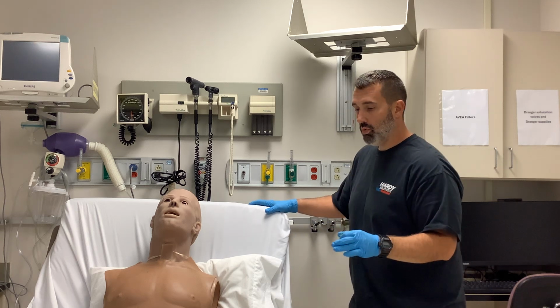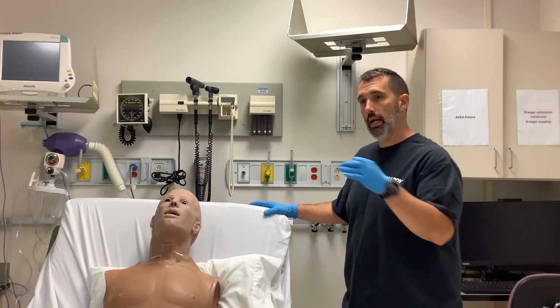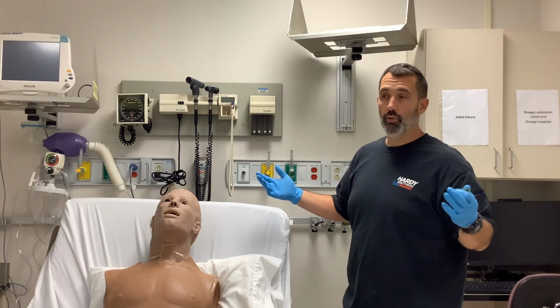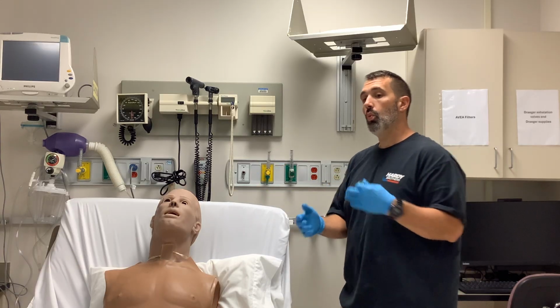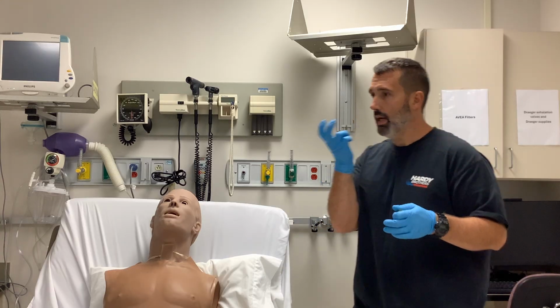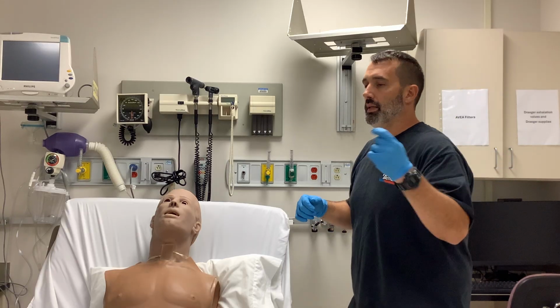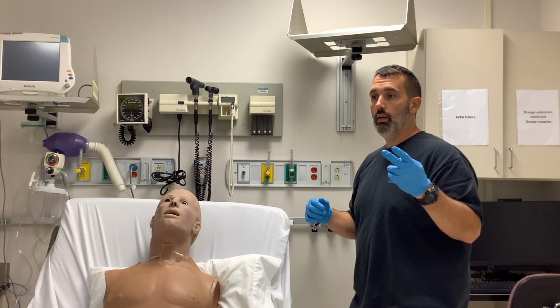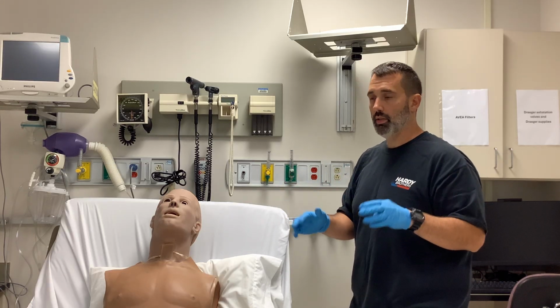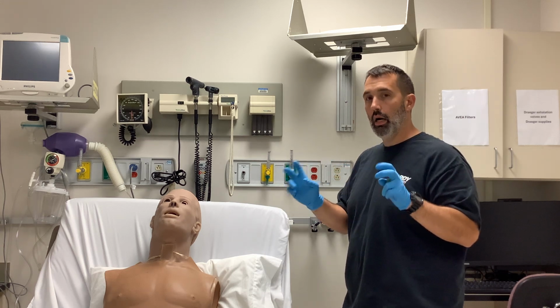On that note, we're going to talk about the difference between the fraction of inspired oxygen and the fraction of delivered oxygen. So your FiO2 versus your FdO2. Is there a difference? There absolutely is. We estimate that with a nasal cannula, which you place inside of the nose, around the ears, and tug up under the chin, a nasal cannula at roughly 2 liters per minute, assuming a normal tidal volume, respiratory rate, and inspiratory flow pattern, you're going to roughly have about 28% oxygen that's being breathed in.